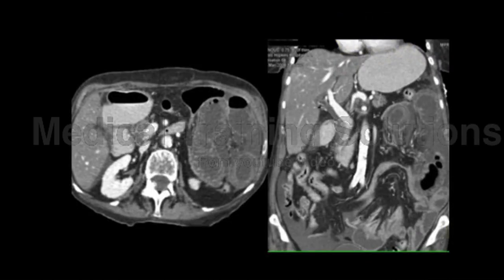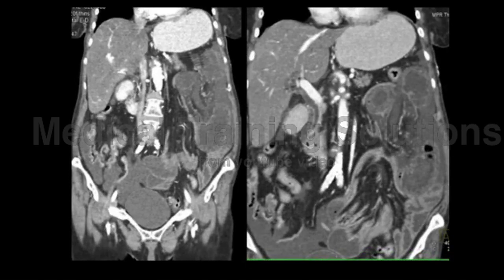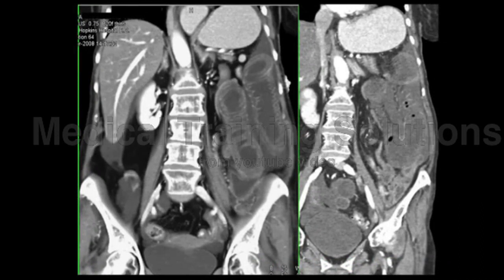Well, when you take that into a coronal plane, you really appreciate how the bowel is herniated and you have an internal hernia. Look at the twist in the left lower quadrant. Look at the normal bowel in the right lower quadrant compared to the abnormal bowel in the left side of the abdomen. Couple more views of that, very nicely showing you an internal hernia. So things we see: bowel's dilated, there's wall thickening, there's lack of enhancement, it's in the wrong position. Everything on the 3D left, 2D right, everything you need to know, it's a surgical emergency.